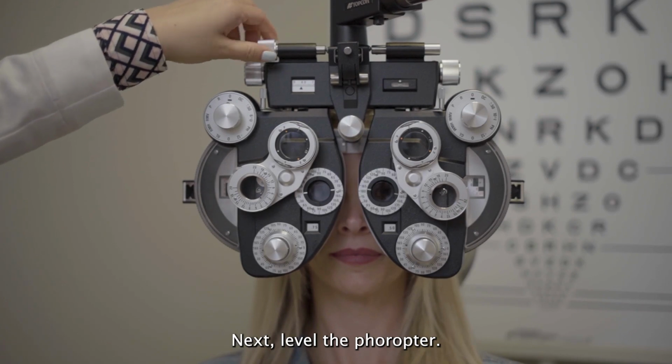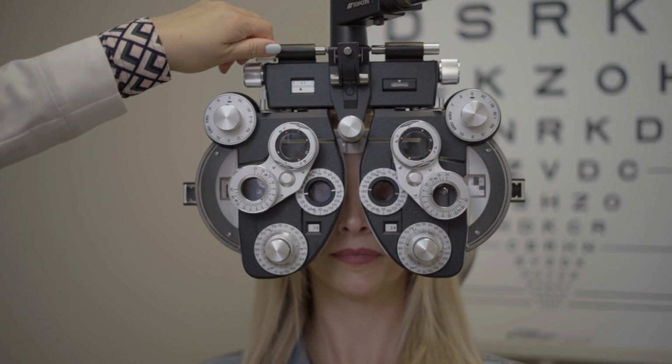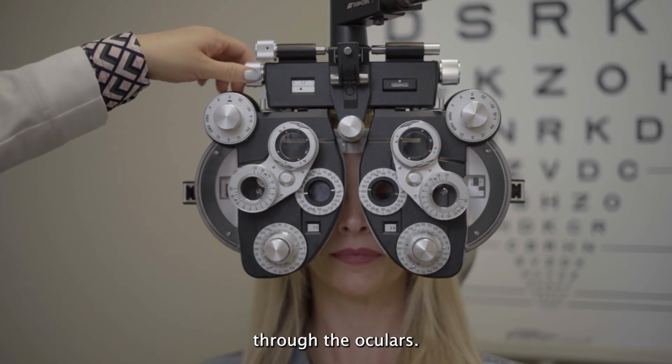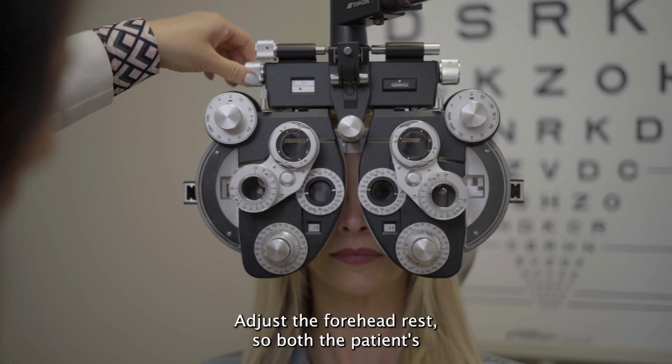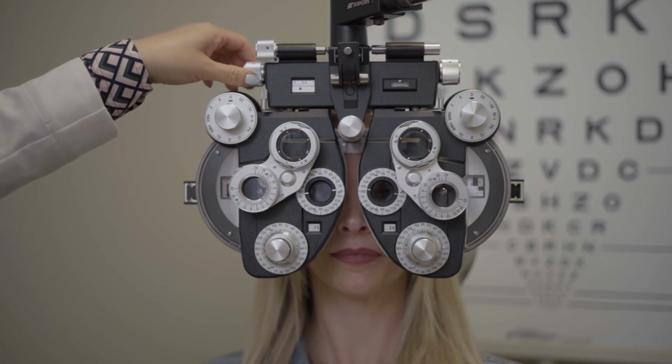Next, level the phoropter. For most phoropters, you will center the bubble. Adjust the pupillary distance so the patient's pupils are centered through the oculars. Adjust the forehead rest so both the patient's head and vertex distance can remain stable.